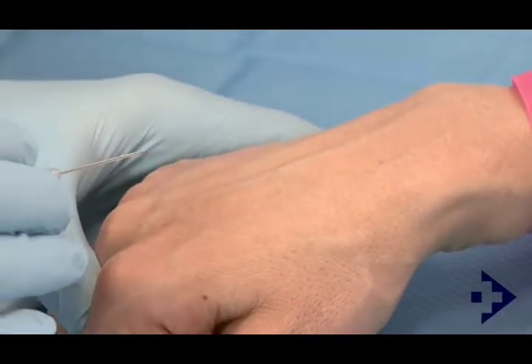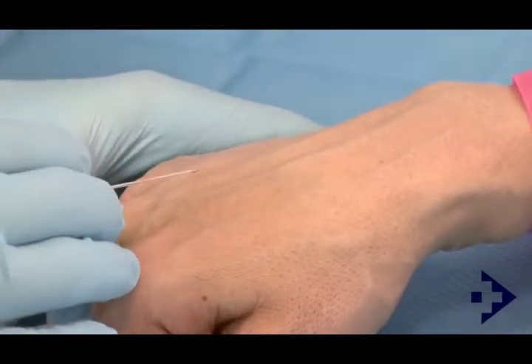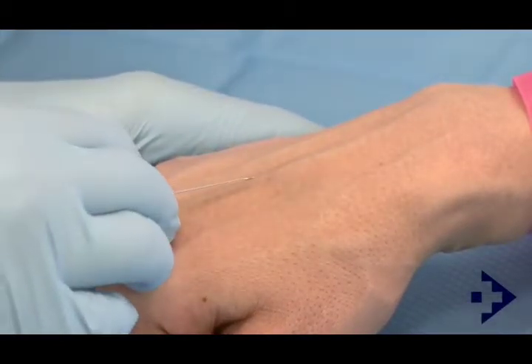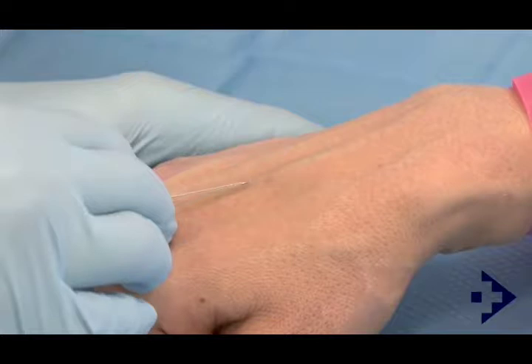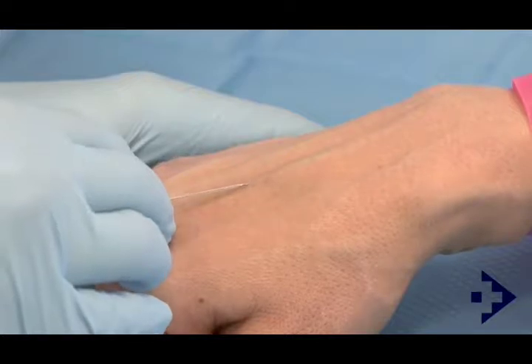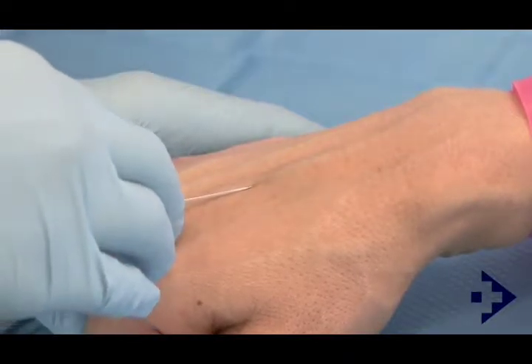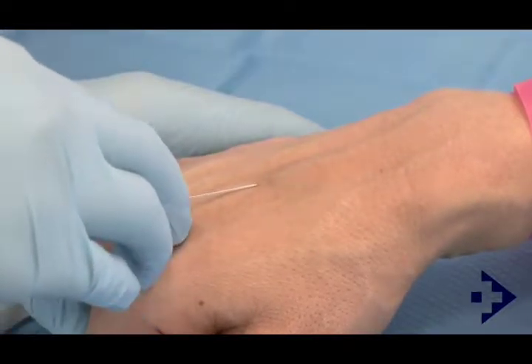Gentle traction is applied to the skin. The cannula needle is inserted with the bevel pointing upwards. It's introduced at an angle about 20 degrees from the skin's surface.